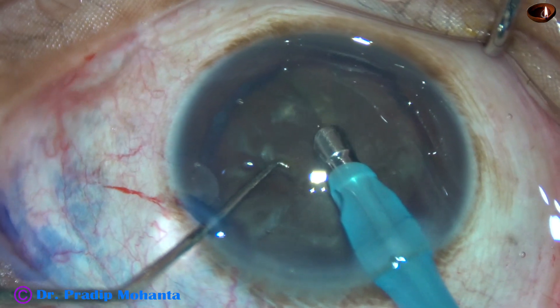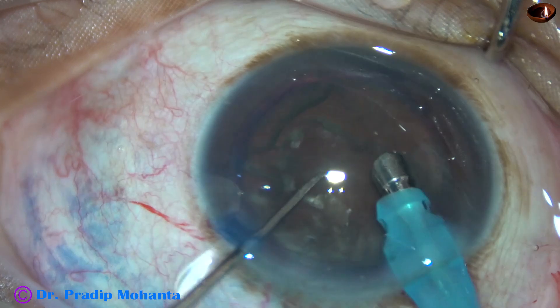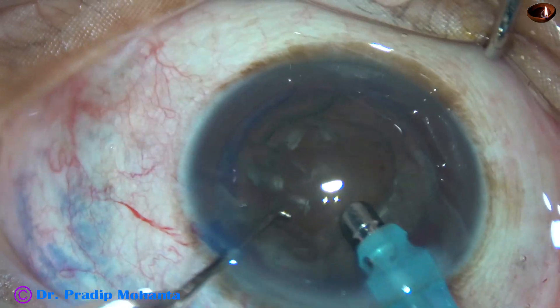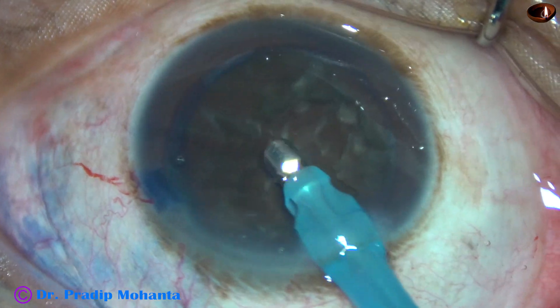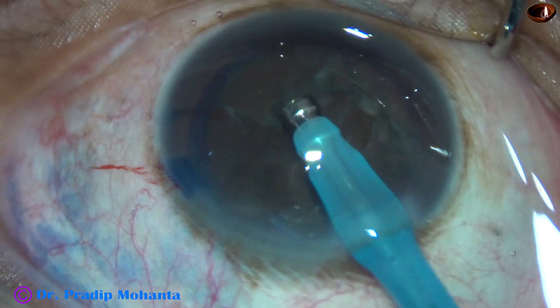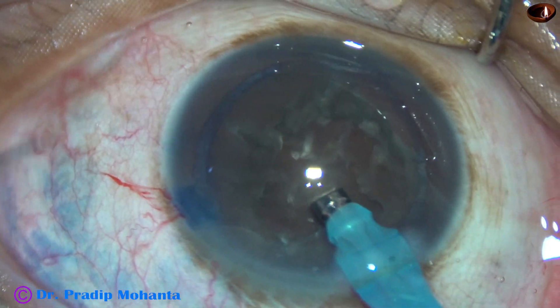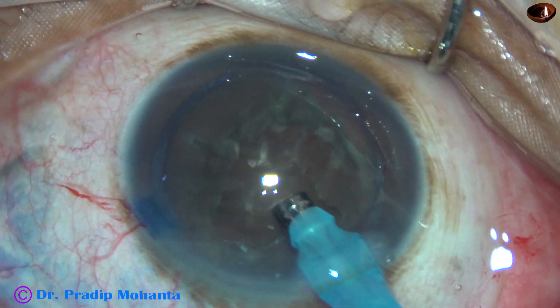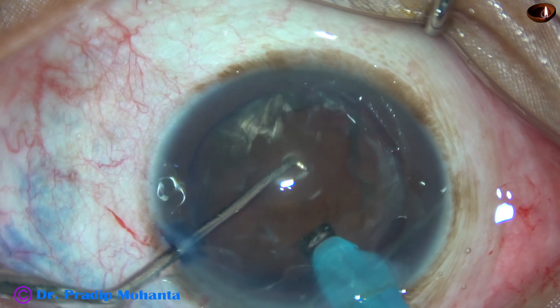A little bit of superficial cortical lens matter is removed. The handpiece is then turned to make the bevel up. Now the tube will go into the substance of the nucleus and move through the nucleus like a submarine.